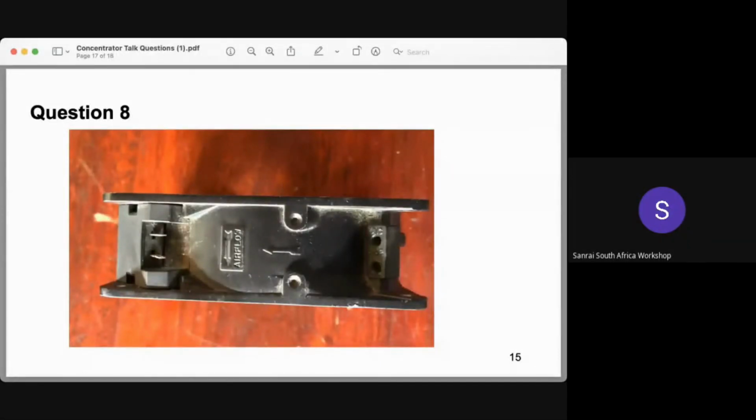Every oxygen concentrator has a fan or fans, and usually the fan is located next to the compressor. This is because its purpose is to cool the compressor and ensure that the recommended working temperature range is maintained inside the oxygen concentrator. The recommended working temperature range varies with the brand and model of the compressor. For the DeVilbiss 525 compressor, the temperature range is 5 degrees Celsius to 40 degrees Celsius. When the fan is faulty, the compressor overheats, just like it did in your case, and eventually shuts down. This is mainly because every compressor has a thermal switch that switches off the compressor once a particular threshold temperature is reached. In this case, the temperature was above 40 degrees Celsius.